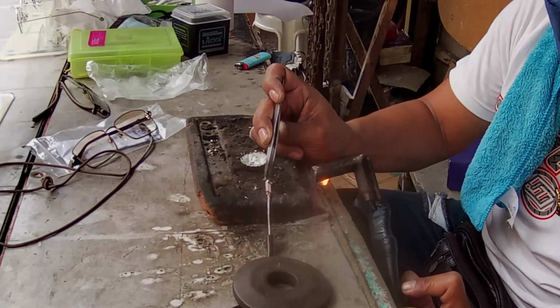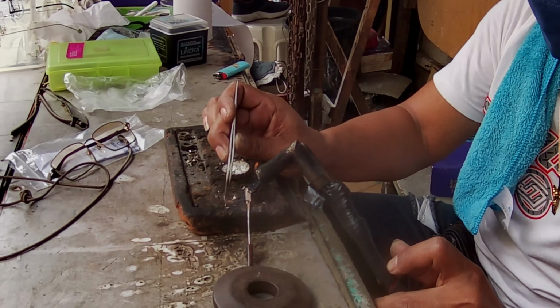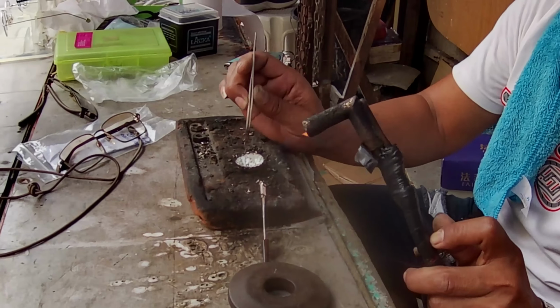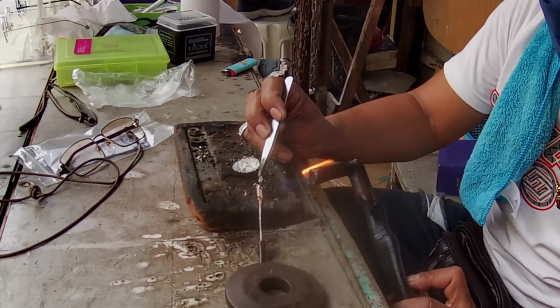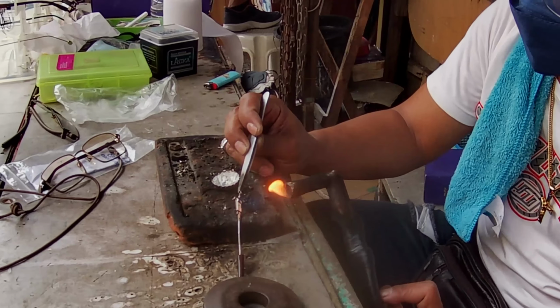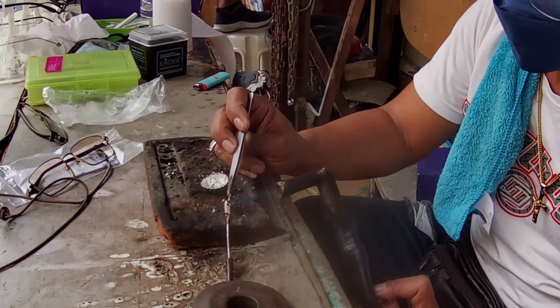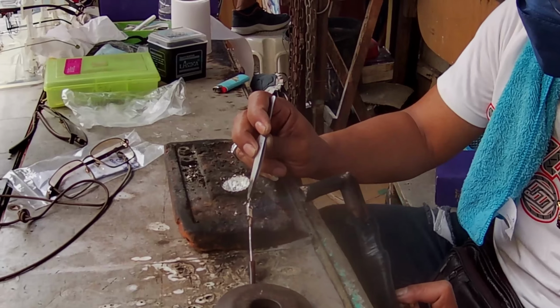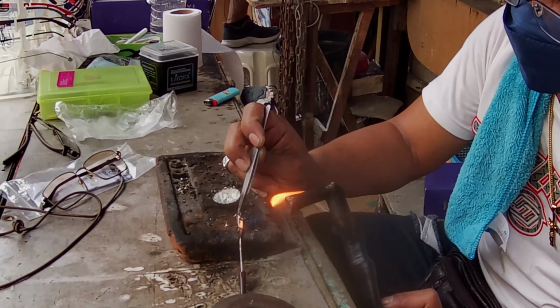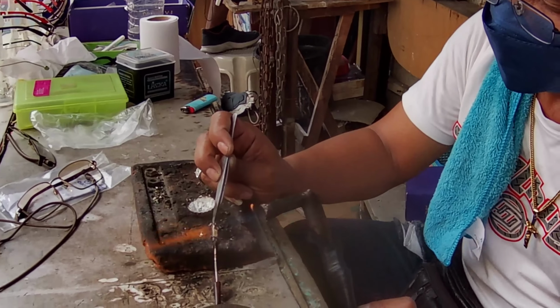Now he's not burning the glasses, and is joining the broken one to the arm. So they need to be careful. This is a professional. You can see this guy, this kind of technician.